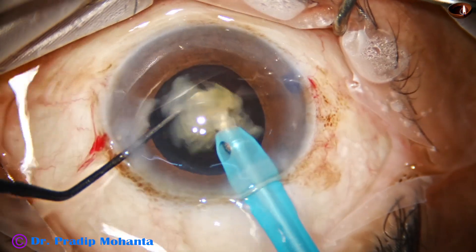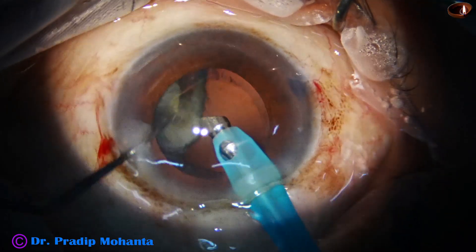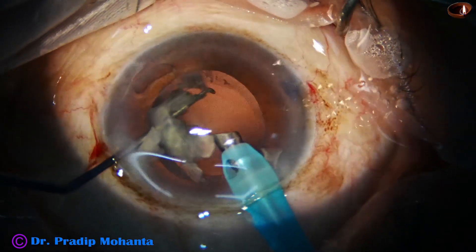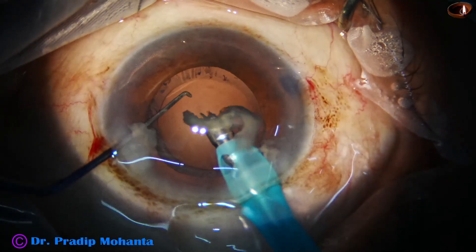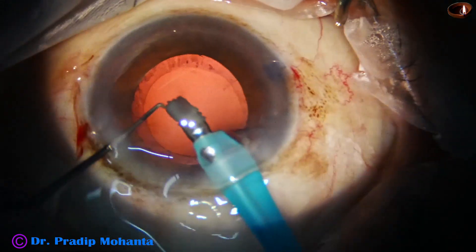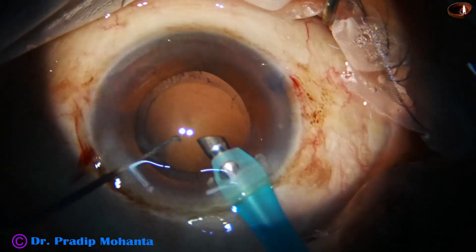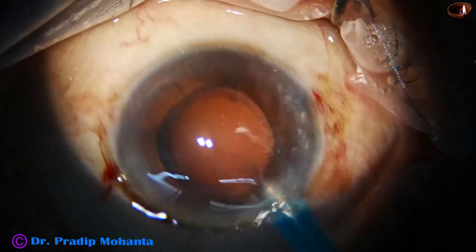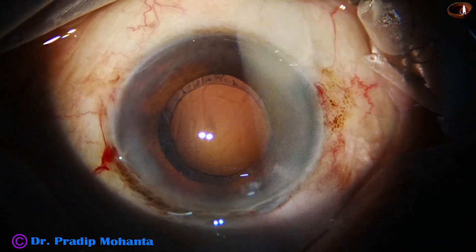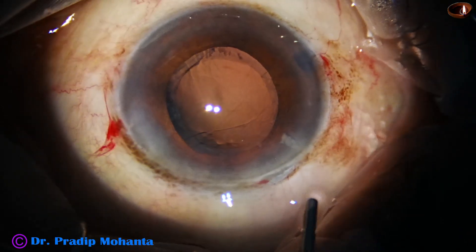This is the last piece of nucleus. At this time we go to stereo coaxial illumination — you can see the posterior capsule very nicely. The nucleus has been nicely managed and there is hardly any cortex left — almost no cortex.